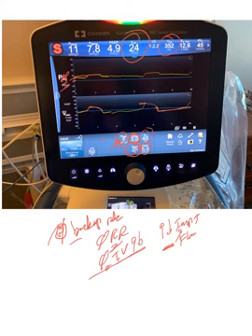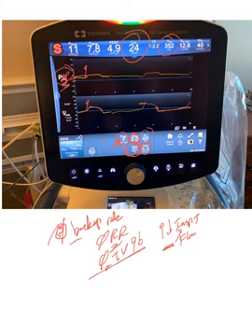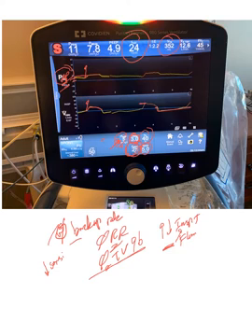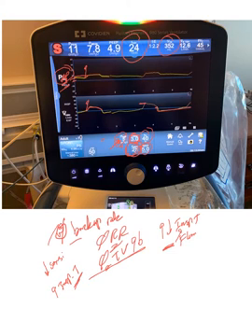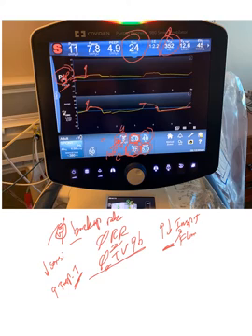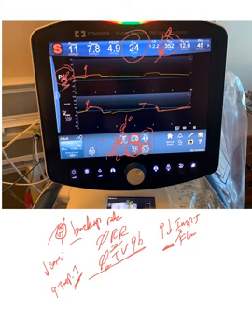The flow rate is affected by how high the pressure is, because higher required pressure leads to higher flow needed. The inspiratory time is also affected by the 25% cycle sensitivity — if you pick less than 25%, that leads to increased inspiratory time, and vice versa. For example, if I make this 10%, tidal volume will go up; if I reverse it, tidal volume will go down. So you need to provide: no respiratory rate, no tidal volume — just FiO2, PEEP, flow sensitivity, the cycle, the patient trigger, and the pressure target.